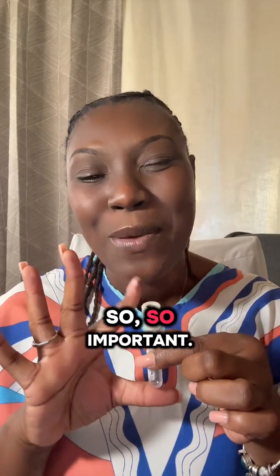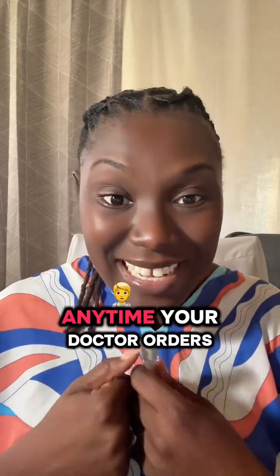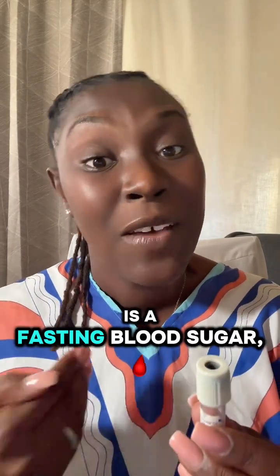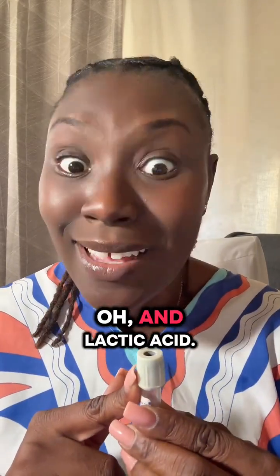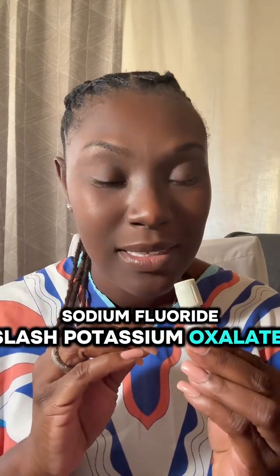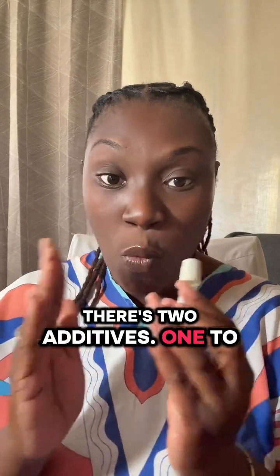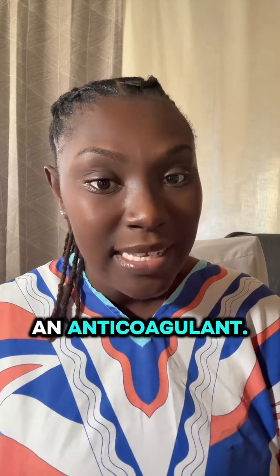Anticoagulants. Finally, we have our gray top. So important. This category goes for glucose. Anytime your doctor orders a GTT or a FBS as a fasting blood sugar, you will collect it in this. Oh, and lactic acid. Now, this is a sodium fluoride / potassium oxalate. There's two additives, one to preserve glucose and the other is an anticoagulant.